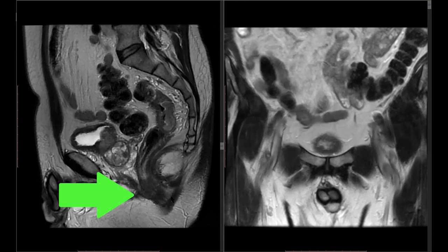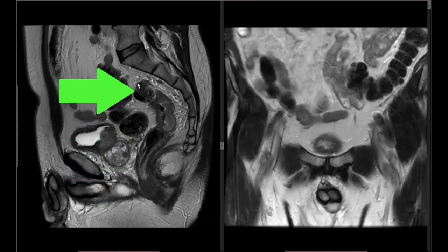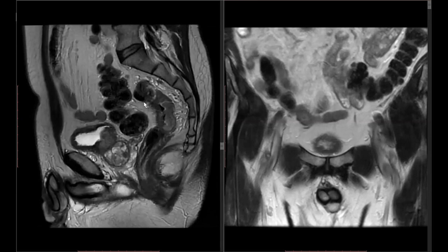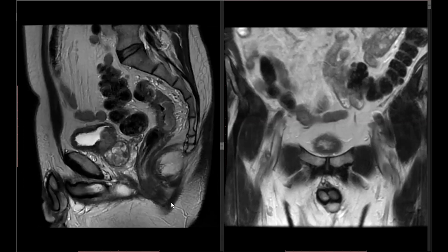You start at the anal verge, go along the axis of the bowel lumen for 15 centimeters, and that identifies the rectum. This anatomic definition is unique in that you are including the distal two to three centimeters of the anal canal as part of the rectum — you are not distinguishing the rectum and the anal canal separately. So the rectum constitutes the 15 centimeter distal end of the GI tract extending from the anal verge.